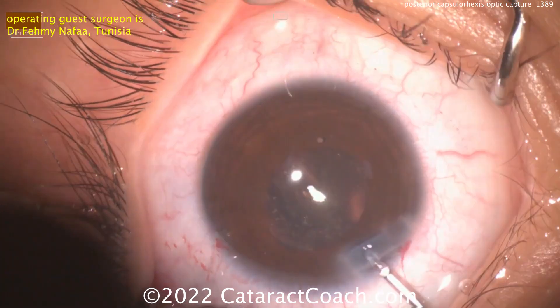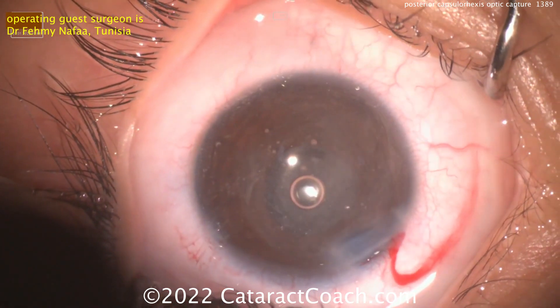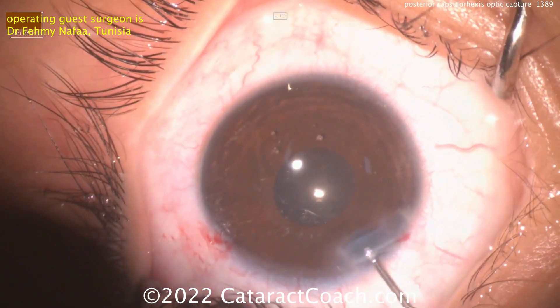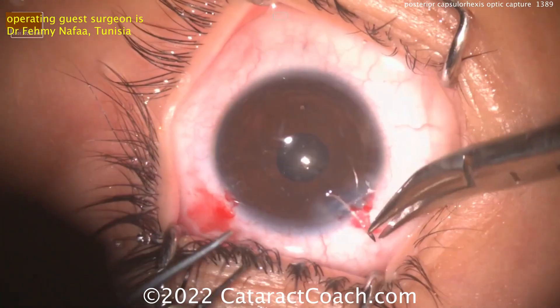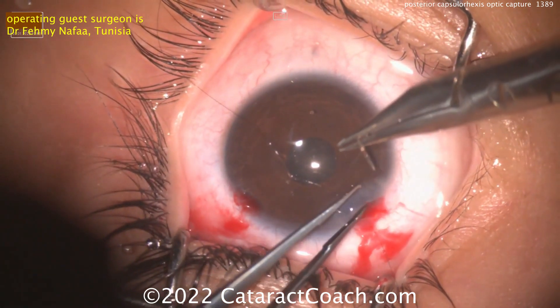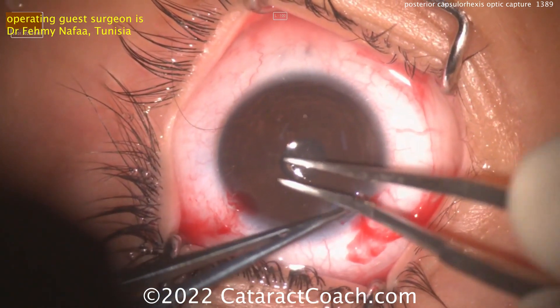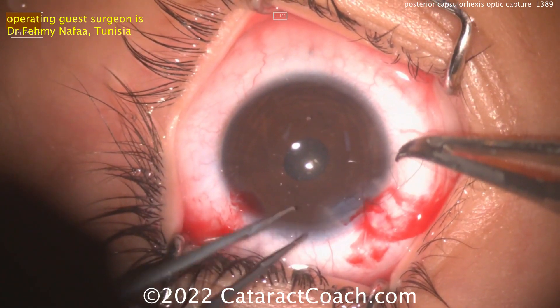The incision can be sealed up, the viscoelastic removed, and this case will be done shortly. A little triamcinolone is also very helpful in these young patients because they get a lot of inflammation. You may want to suture the incision — I like that idea. You can use 10-0 nylon if the patient is cooperative and bring them back to the slit lamp to remove it later. If the patient is going to be less cooperative, you can use 10-0 Vicryl because that will dissolve on its own.